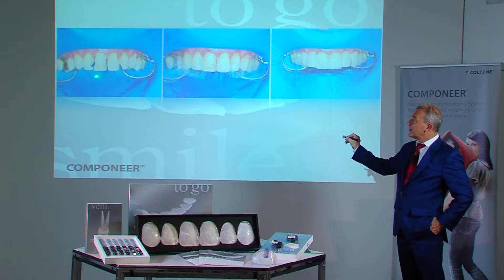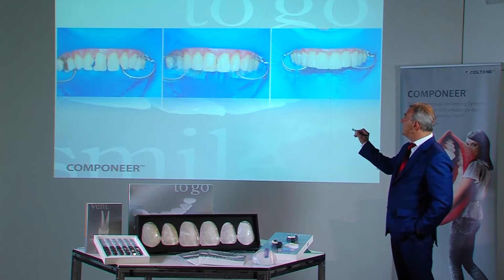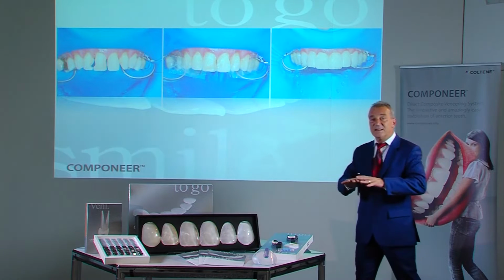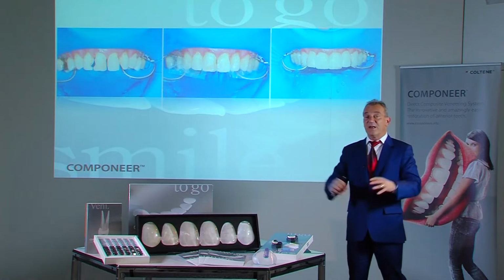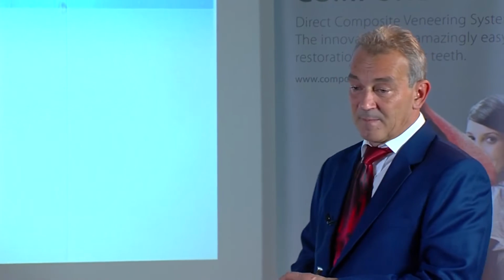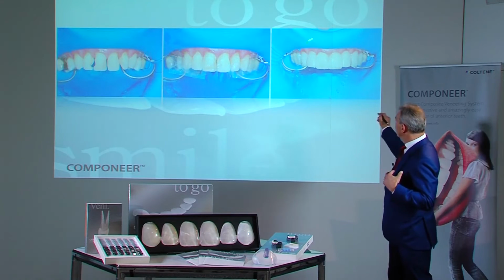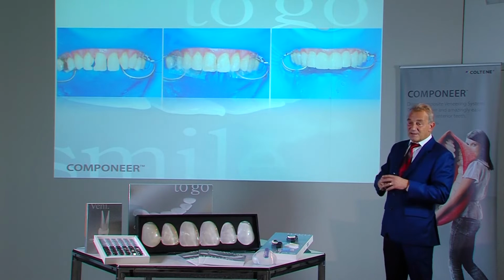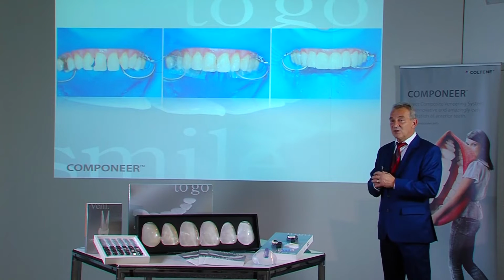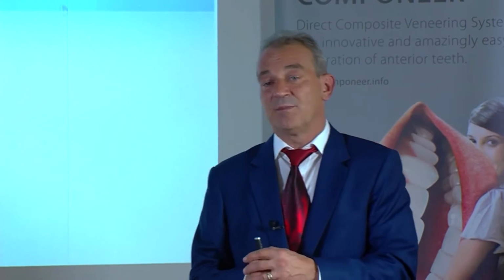First, the old restorations were worked up with dentine mass so that the background is more or less homologated. Then the Componeer is applied. As we can see on the images, left and right are the pencil markings, which were made immediately after placing and curing the Componeer.